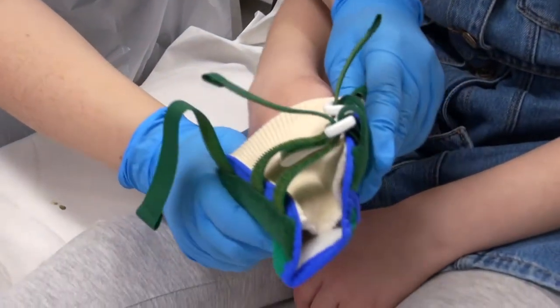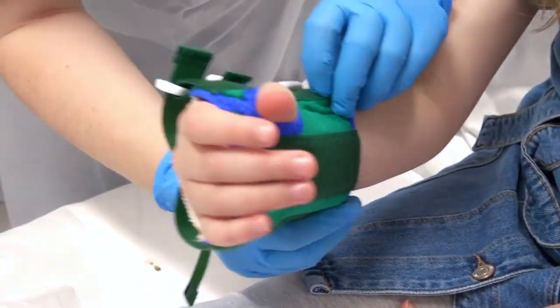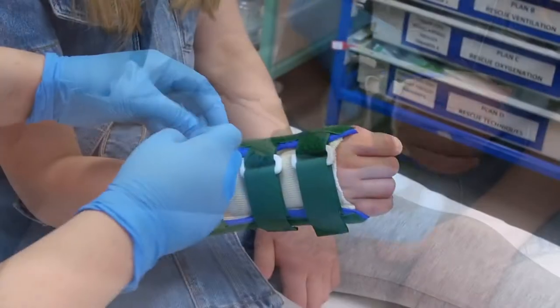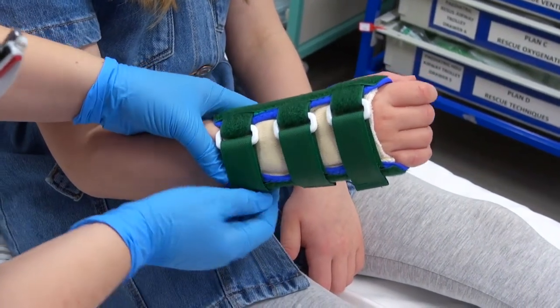Slide your hand in for us. Perfect. And then you've got a thumb on there. And then you just tighten it up — not too tight, but tight enough, so it's nice and supported.